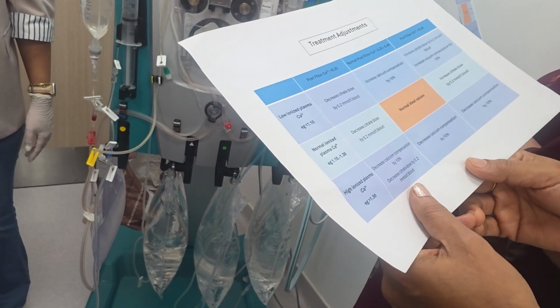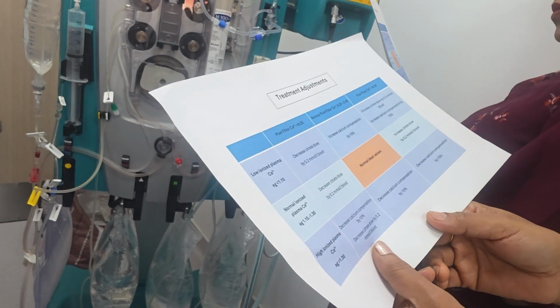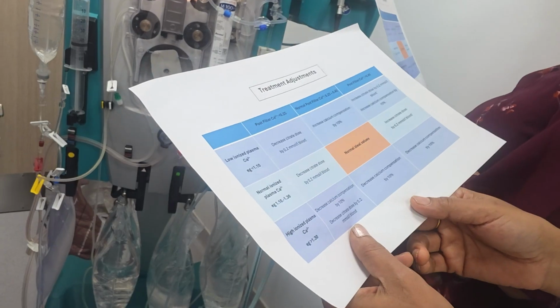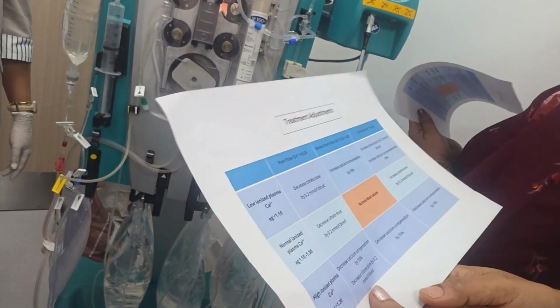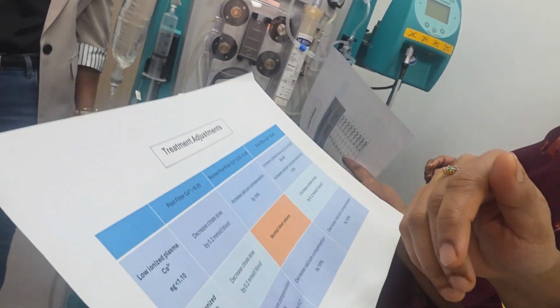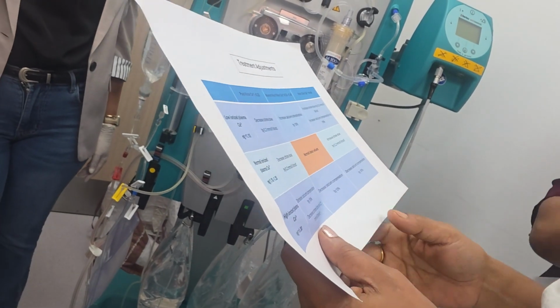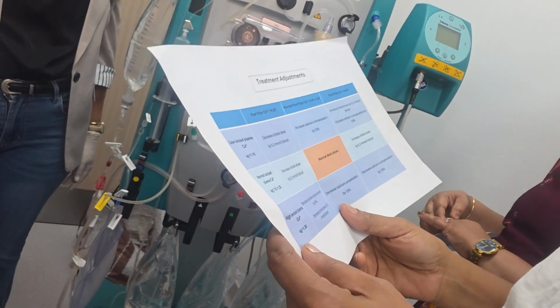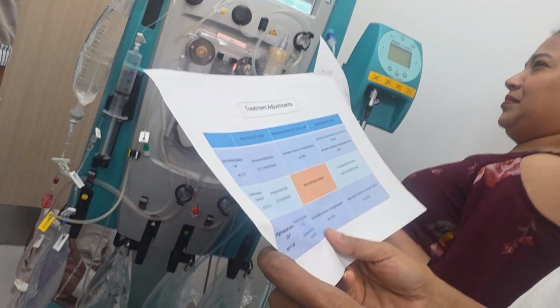The blue one is 23 and the orange one is 25. The orange one will not reach. Size 22 is accurate. Not a 20 or 21, it's very big, so the rubber might rupture. 22 and 23, these are good.